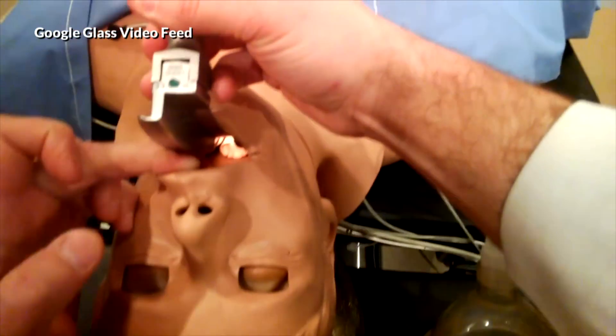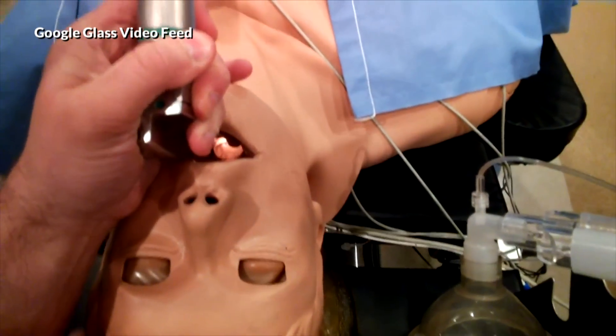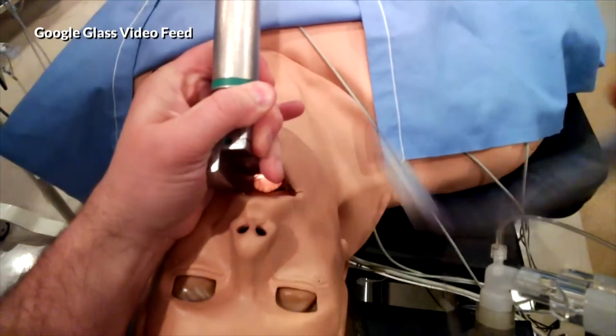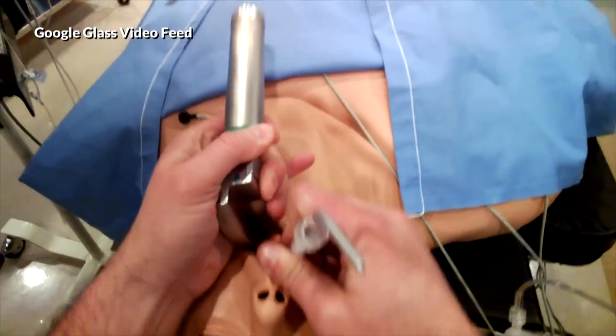Okay, and I'm going to get it right underneath the epiglottis. Okay, and so what we can do is then we just slide the tube right in there in the airway. All right? And we're in.